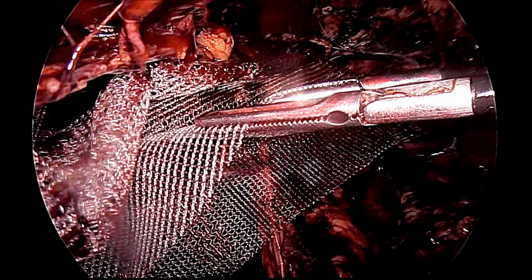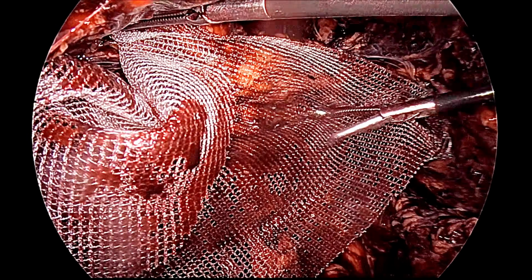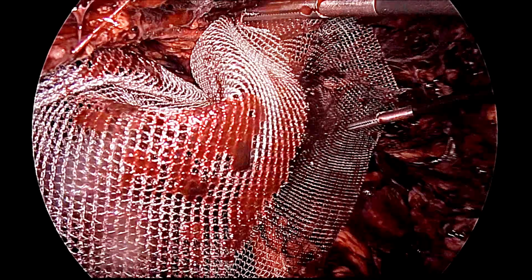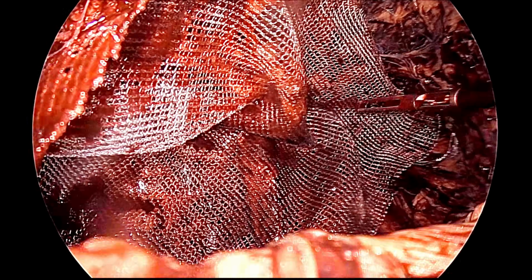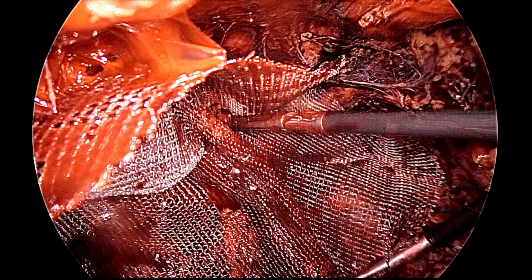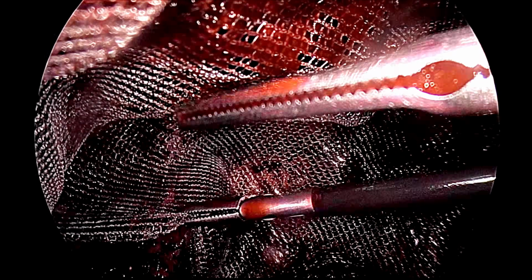So, this is very important that the mesh should be placed properly, because it is like an open book in front. Half below is peritoneum, half above is anterior abdominal wall. So, if you put it the wrong way, then once the gas is removed, the peritoneum will fold, and once the peritoneum folds, there will be recurrence. So, we should be very careful, and we have to spread it keeping the center of the defect in the center of the mesh, and then the recurrence will not happen.